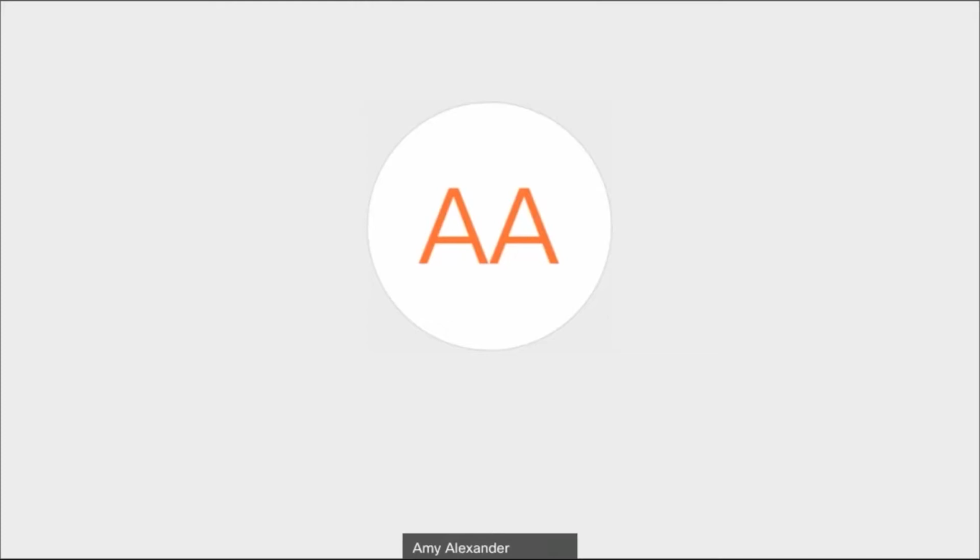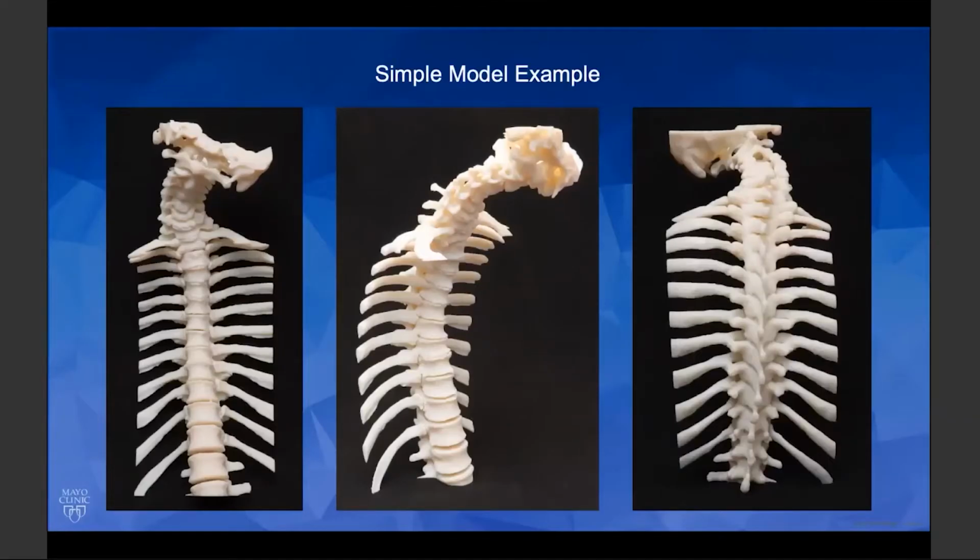a 3D printed spine model. So this model is a spine. The patient was a 74-year-old male with severe cervical thoracic deformity, and the model was to help in the correction of that deformity. This model was printed on a Stratasys Objet 500 Connex 3 printer, mostly because of the build volume size of that printer.